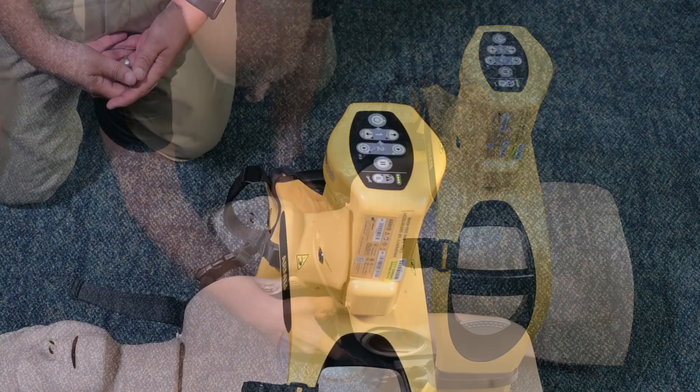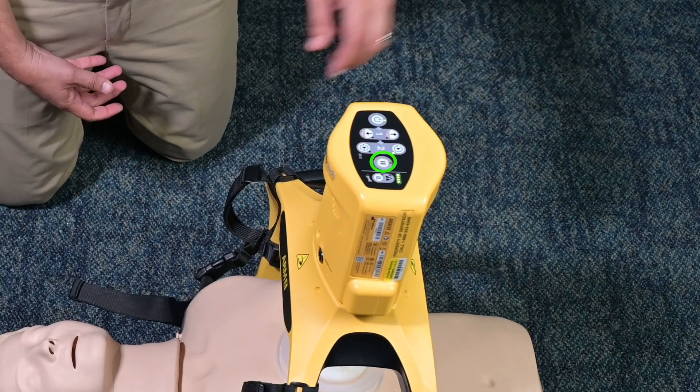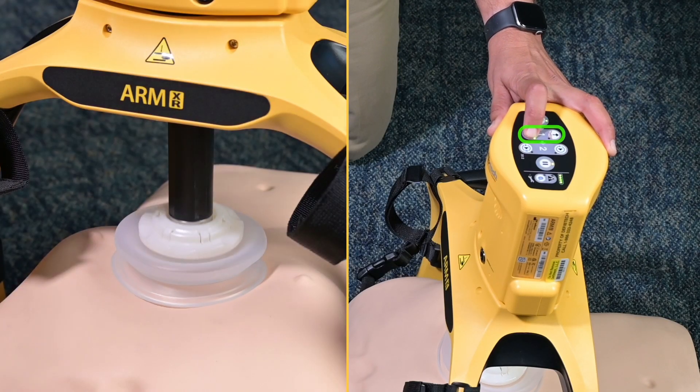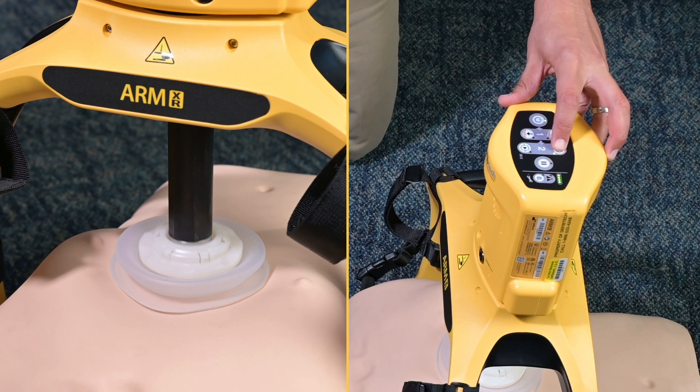To temporarily stop compressions for any reason, press the Pause button. If necessary, before resuming, adjust the suction cup position using the adjust up and down buttons so that it makes firm contact with the patient's chest. Then resume compressions.